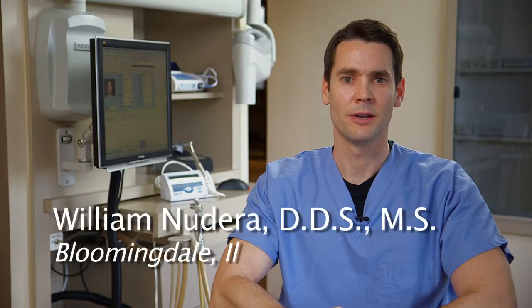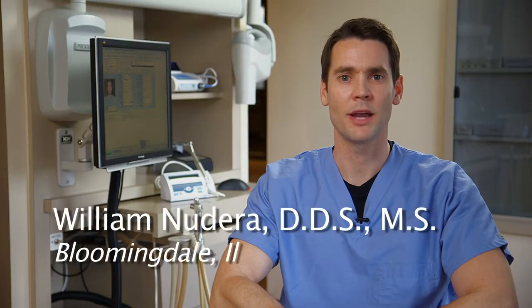I'm Dr. William Nudera, an American board-certified endodontist practicing in Bloomingdale, Illinois, right outside of Chicago. I'd like to take a few moments and walk you through a treatment case in which I use the WaveOne reciprocating instrument in order to achieve my final shape. This is a bit of a challenging case, but it does demonstrate the unique capabilities of this particular instrument.